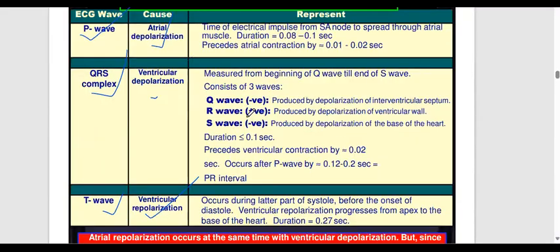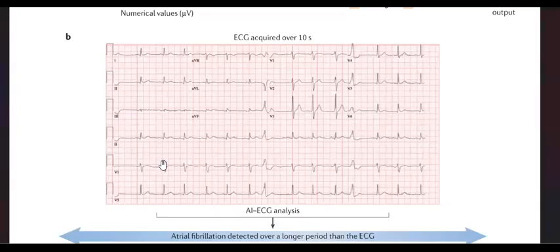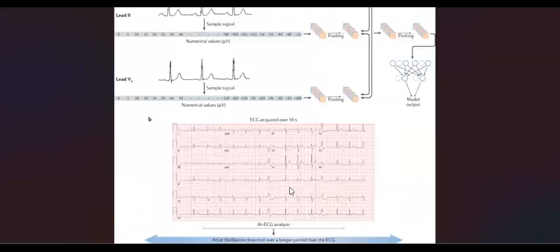Where do we have the image? So this image, this is the main one. This is every single different area: lead one, lead two, lead three. Okay, and we have V1, V2, V3. So it is the area where we have to see the graphs.